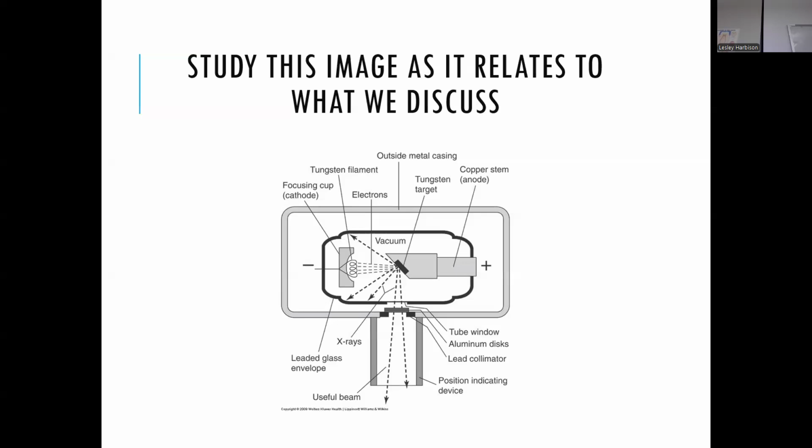If you take it out of the X-ray machine, it looks like glass, but it's leaded. So X-rays can't go through it because the lead absorbs them. This whole gray outline is just leaded glass. You can label it leaded glass tube. Either way, I'm not going to get too picky as long as I know what you're referring to.